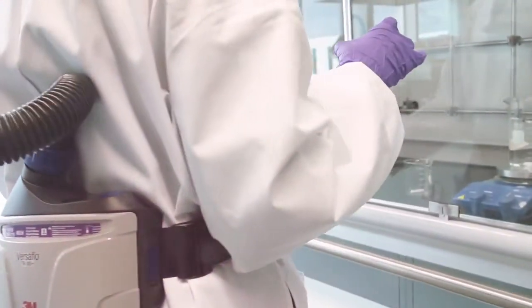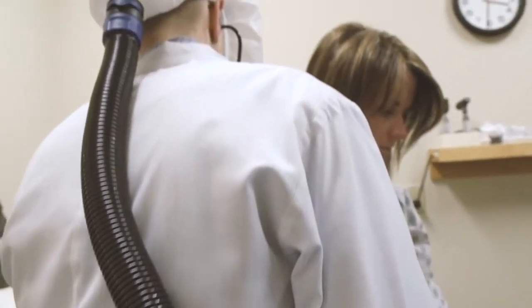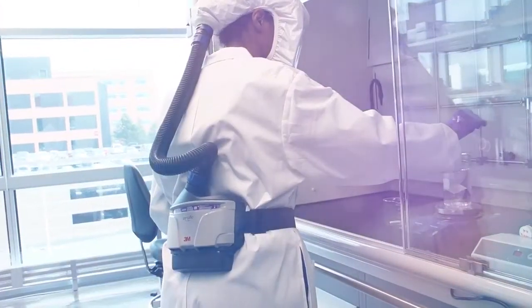At 3M, we took a breath too. We took a breath to do research, to better understand your needs, to create the protection you need with the ease and comfort you want. In essence, we designed this to help make breathing and working easier.